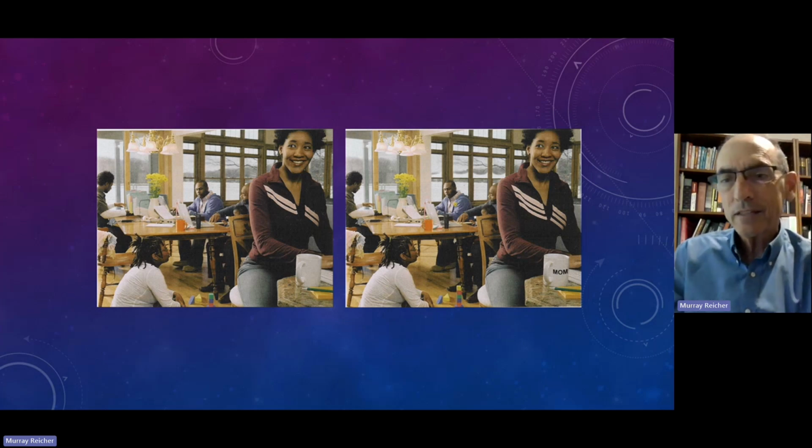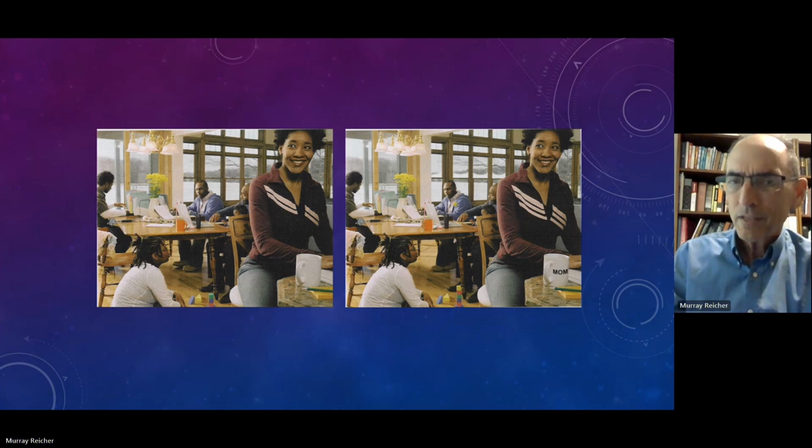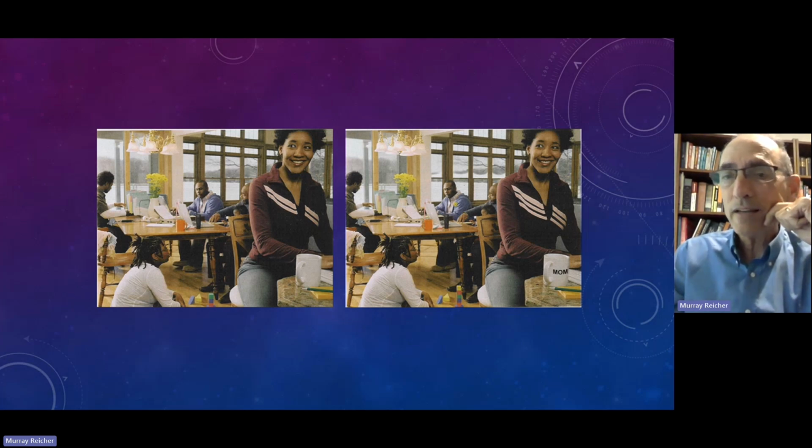Now, recognize that even in the time that this slide has been up, on average, a radiologist in the US would have had to have looked at 20 or 50 different images. But right now, you're just comparing two images, and they're side by side. And the question is, when are you done? How many findings did you see? Well, you can change the way this information is presented to make good radiologists better.